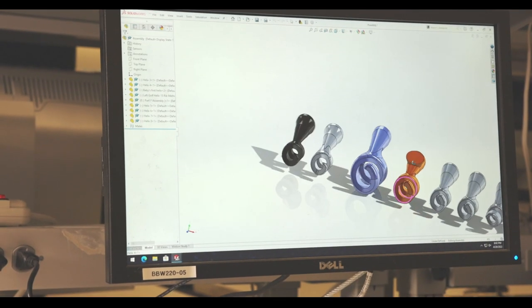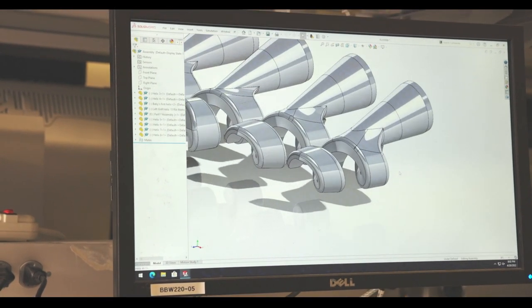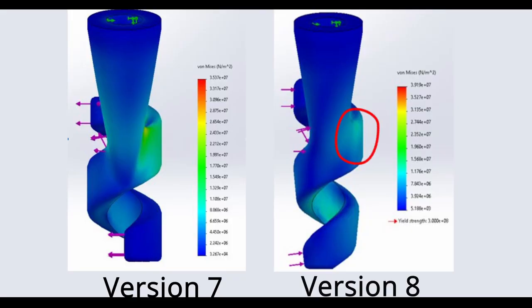Through a few more iterations, we got to our eighth iteration of the Helix, which we re-ran that study again using the same exact forces, and we were able to find much better results with not very many stress concentrations. This was something we were really excited about and made us feel a lot more confident when we moved forward with printing and further testing with Bob.